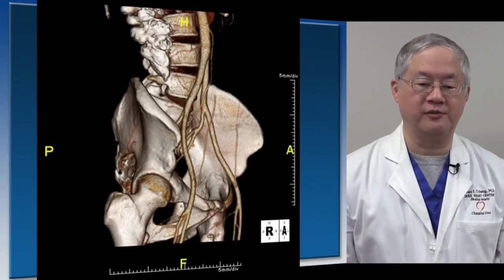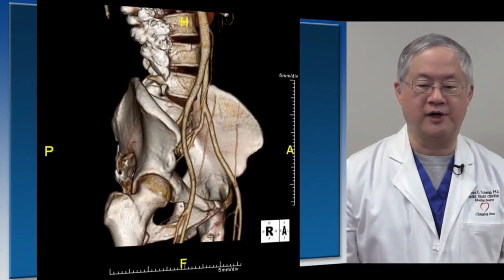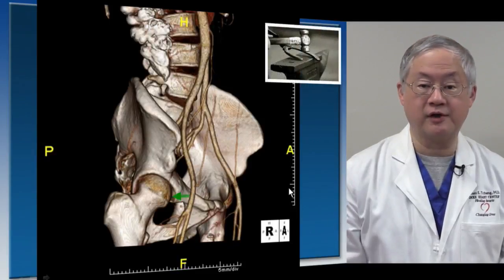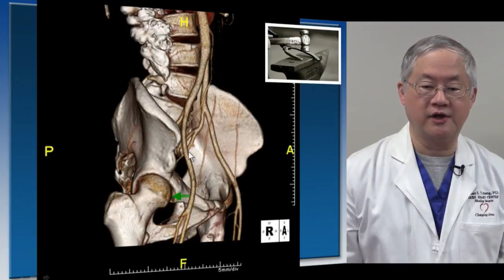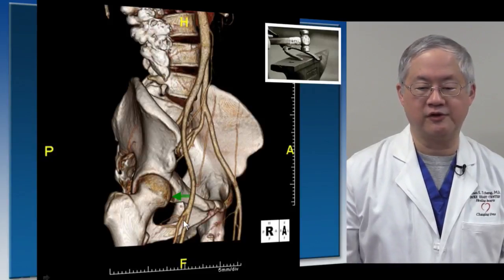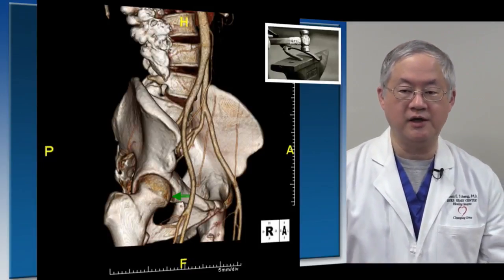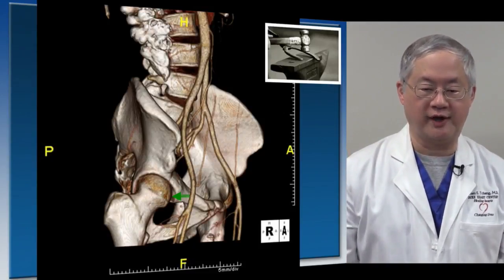I want you to take a look at this image. This is a 3D reconstruction using computed tomography and then reconstruction algorithms to identify the aorta, which you can see up at the top. Let's see if I can get my pointer to work here. Up at the aorta, bifurcating into the iliacs, and then as it crosses around the level of the inguinal ligament, it becomes the common femoral, and then bifurcates into the profunda femoris and the superficial femoral. And because I hit the arrow, it actually shows you the key spot that is the magic or the sweet spot for obtaining femoral arterial access.